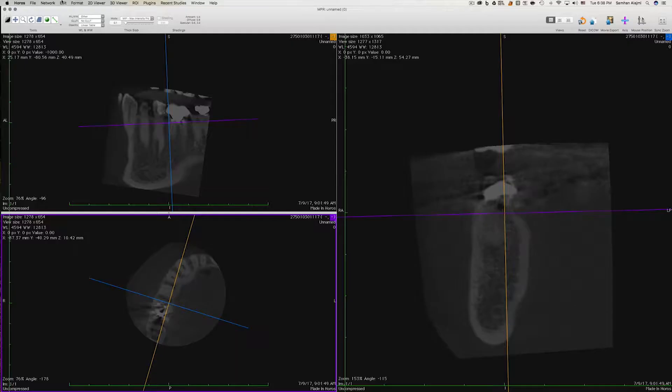I was suspicious, so I decided to take a cone beam CT scan. Let me show you how I usually view CBCT radiographs. Typically when I open CBCT radiographs, I like to open them in the MPR viewer, which stands for multi-planar reconstruction.